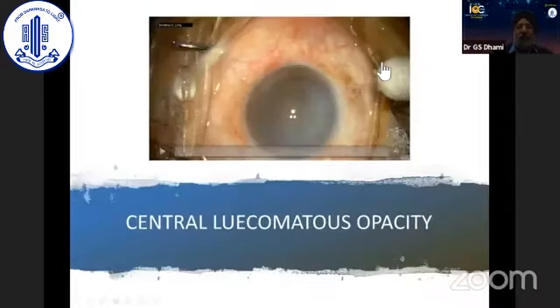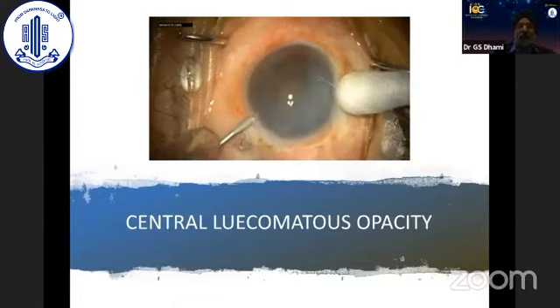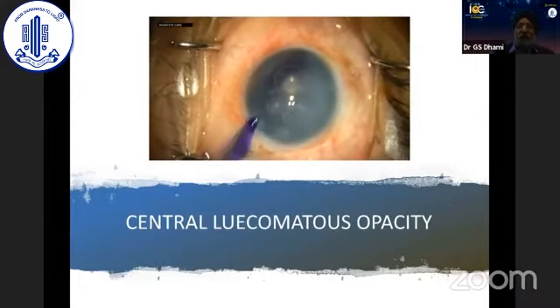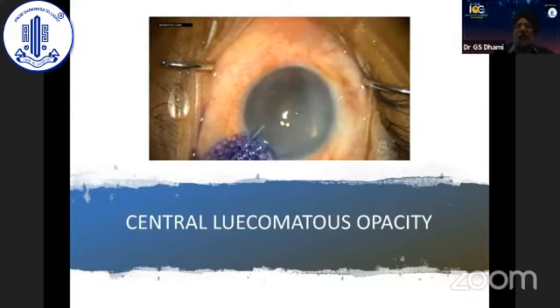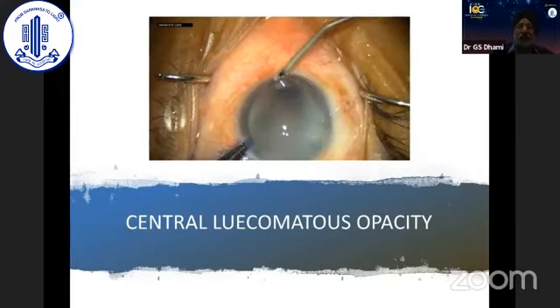Many times you are faced with corneas like this. The patient is not willing for a transplant, but needs his cataract removed for reasons like a little secondary glaucoma and a little visual rehabilitation. These are difficult to approach, but not impossible. Trypan blue staining, a good rhexis under a good viscoelastic, and of course retroillumination is a sure and good method to help.